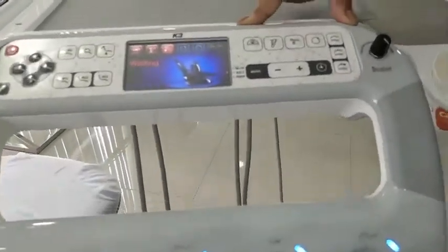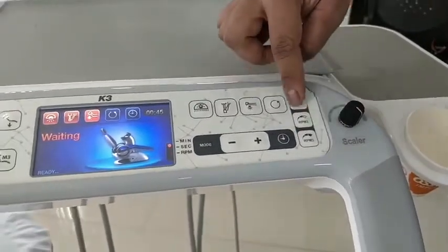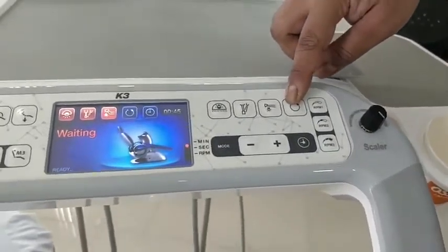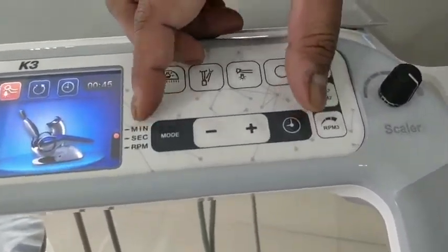These four buttons — one, two, three, four — are for the micromotor handpiece and control its RPM. This button controls the mode for reverse and forward movement, and the RPM levels one, two, and three.